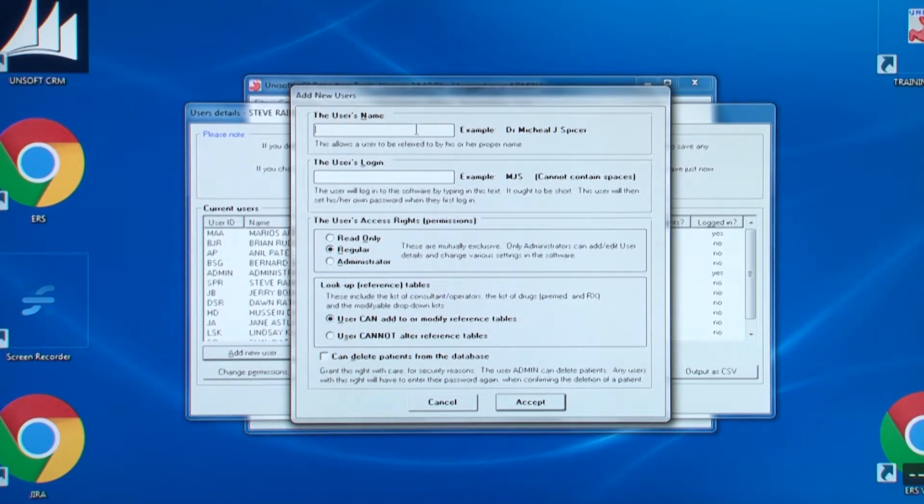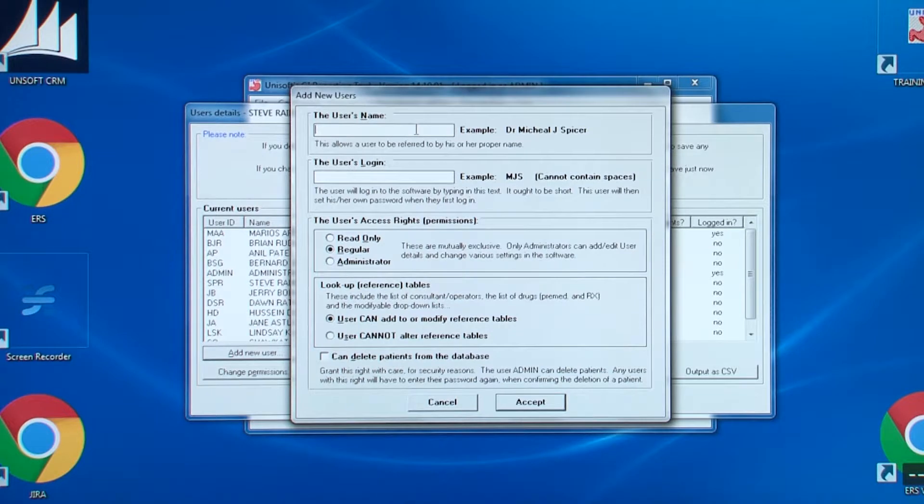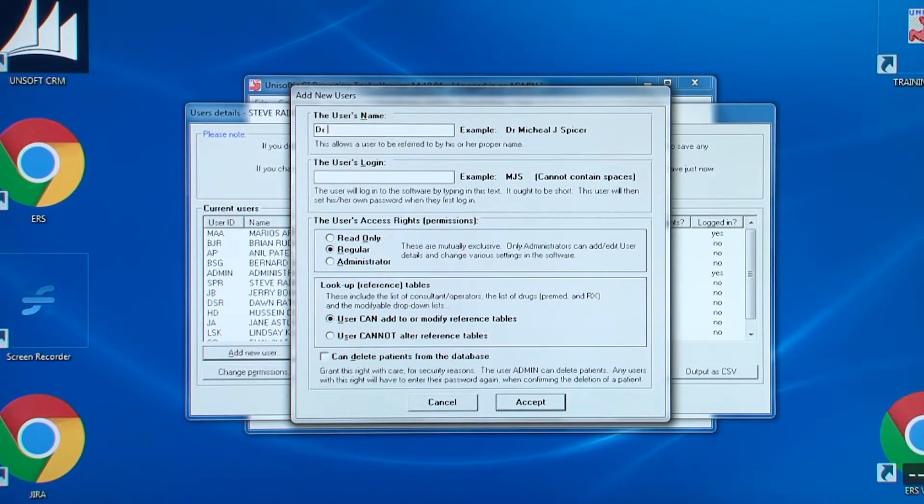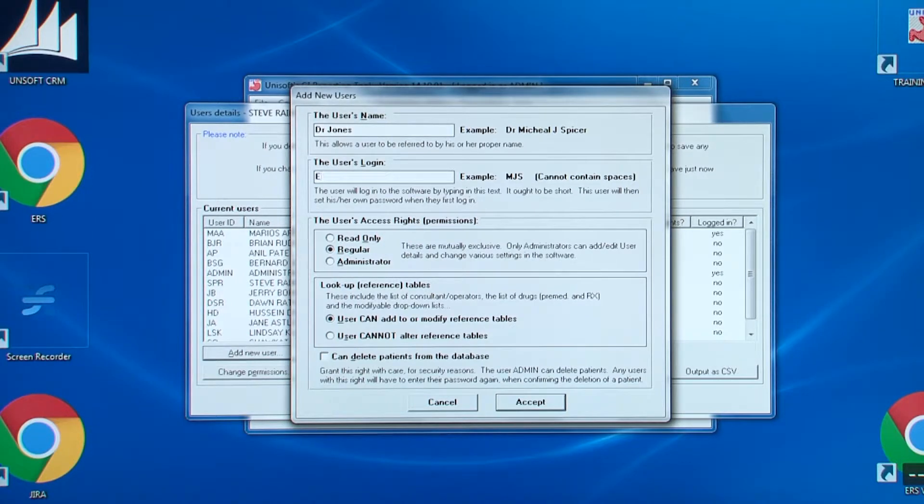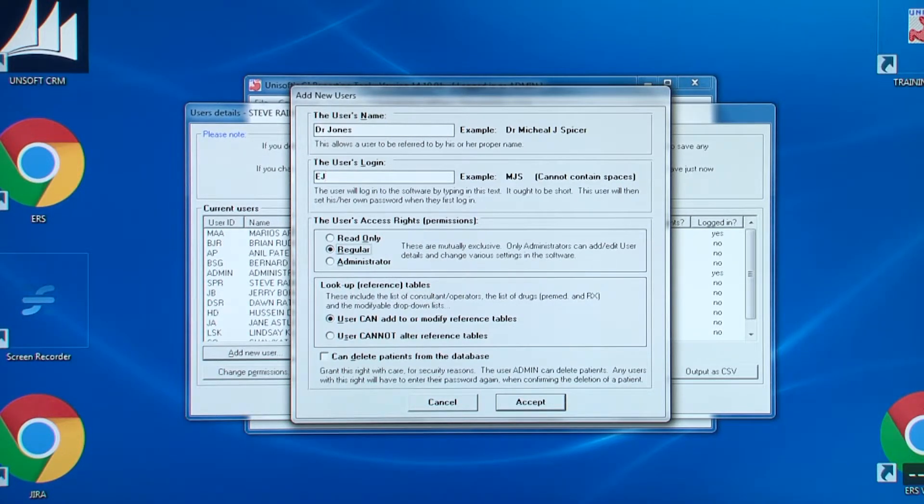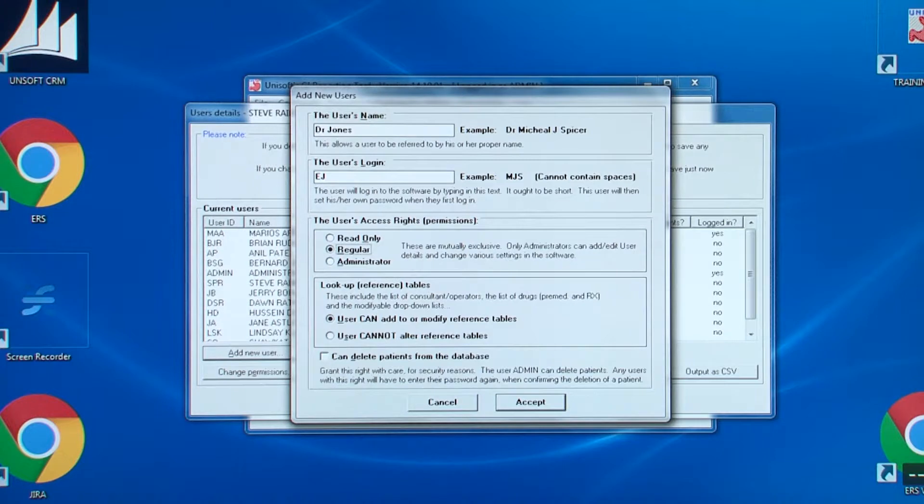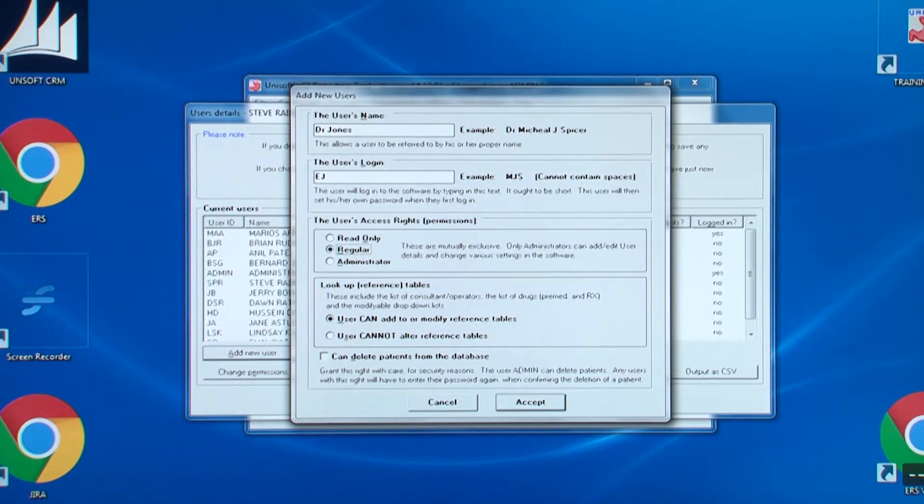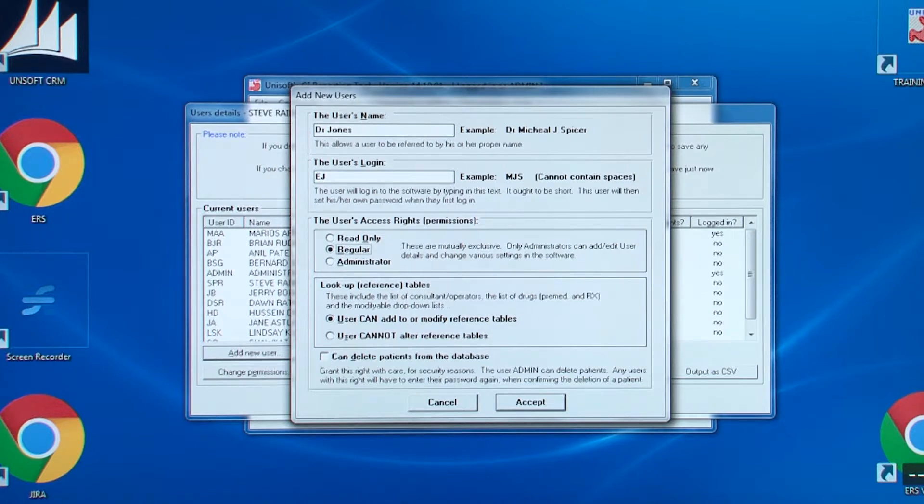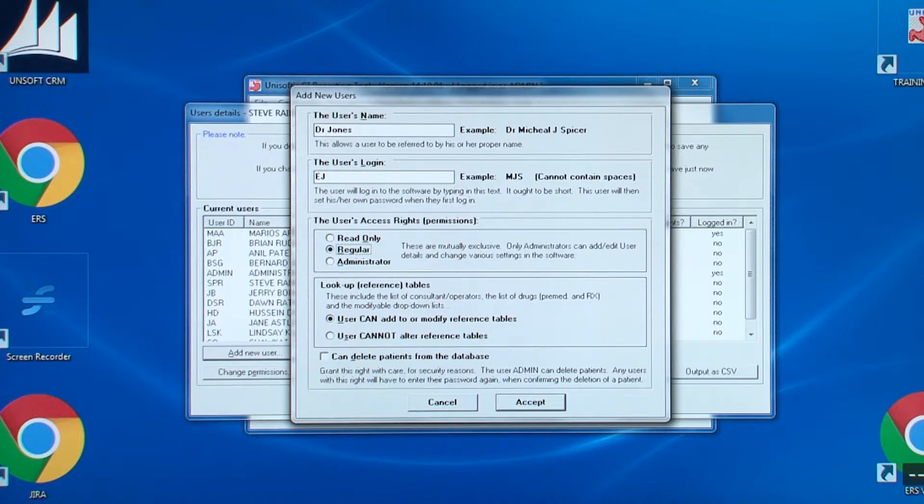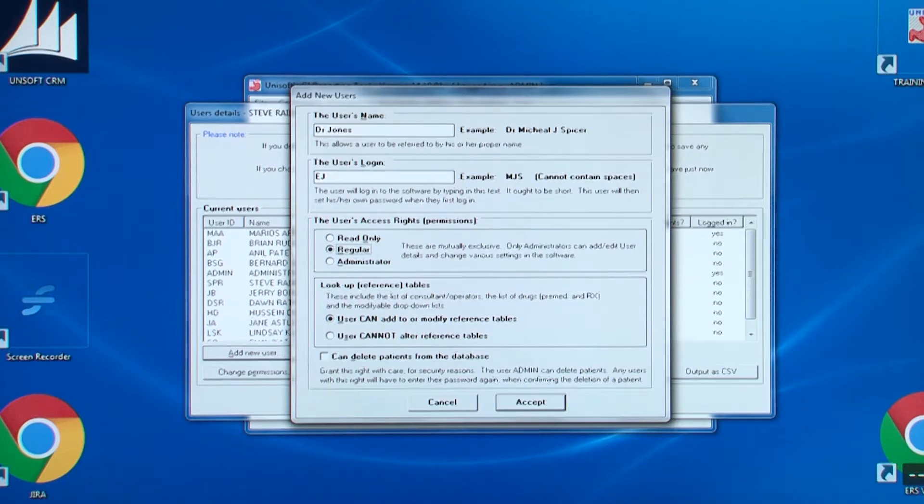So the first field is the user's name. The next thing is their login ID. And contrary to this example, please use their regular NHS or trust login. There is no reason to create yet another login that has to be remembered by the poor user. Next is their access rights: read only, regular or administrator. The default is regular.